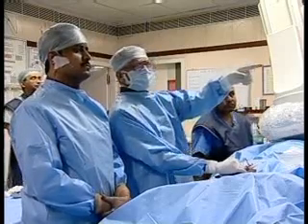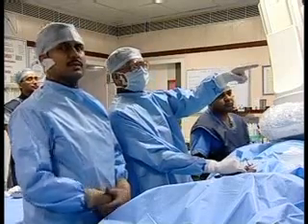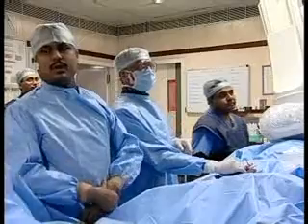Can you go back and show the right side of the renal artery? Dr. Narasimhan, we are just discussing what is the energy that we normally use for RF ablation for AVNRT versus this one. Is it a quarter of it, or what?